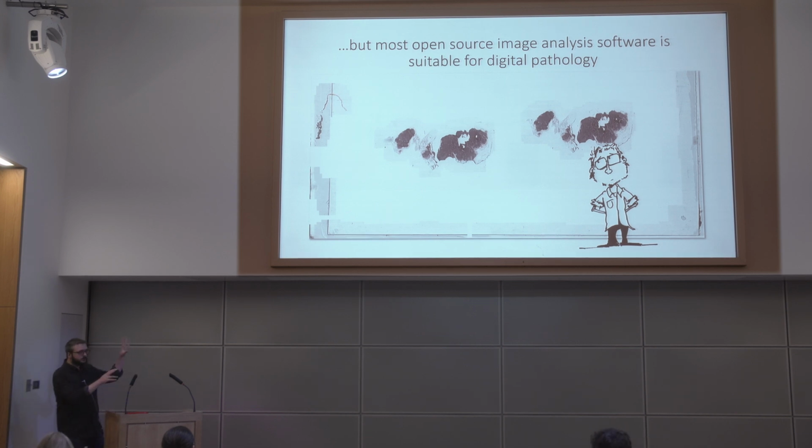So these are huge. You could have a single slide, in this case uncompressed, that's about 60 gigabytes. You can see there's a lot of white space, so you wouldn't necessarily think that it's using the 60 gigabytes quite as it would need to. But if you were to just crop out the tissue region and look at it at full resolution, it would still be about 10 to 15 gigabytes of data. Often the data is JPEG compressed, and it's not terribly good for quantification. But this is the kind of data that is commonly worked with in pathology.